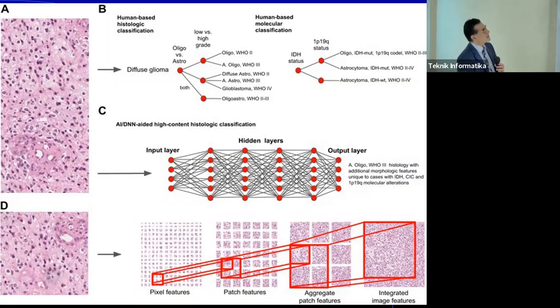in this particular image, which I've taken from a publication, they're using image analysis to try to extract molecular features. So they're doing the image analysis to identify mutations. They've labeled tumors in accordance with presence or absence of mutations, and used that as the only label between the two different categories. This is working on glioma, looking at 1p deletion versus other deletions. So the labeling is done based on their mutation profile.